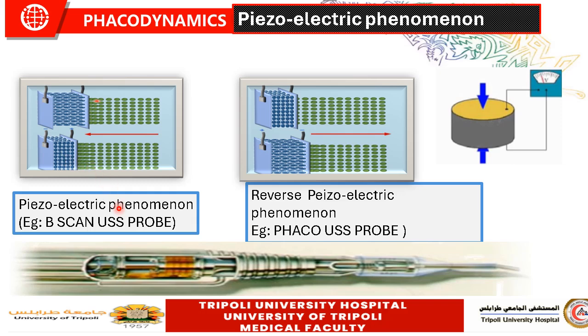When the ultrasound waves are reflected back, they are detected by the transducer in the ultrasound probe, and this creates compression of the piezoelectrical crystals, and then it creates an electrical current that can be detected as a pixel and displayed on the monitor of the ultrasound.